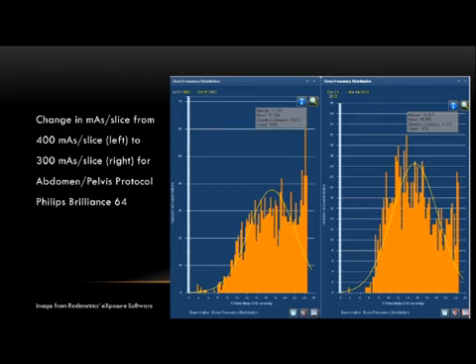Here's an example of what happened at our institution. We changed our image quality reference parameter on our Philips system because we got our dose index registry data back, and we're like, oh, we're above the mean. Let's see what we can do here. So the radiologist and I made a change, didn't tell any of the other radiologists. This was the division head, so it was okay.